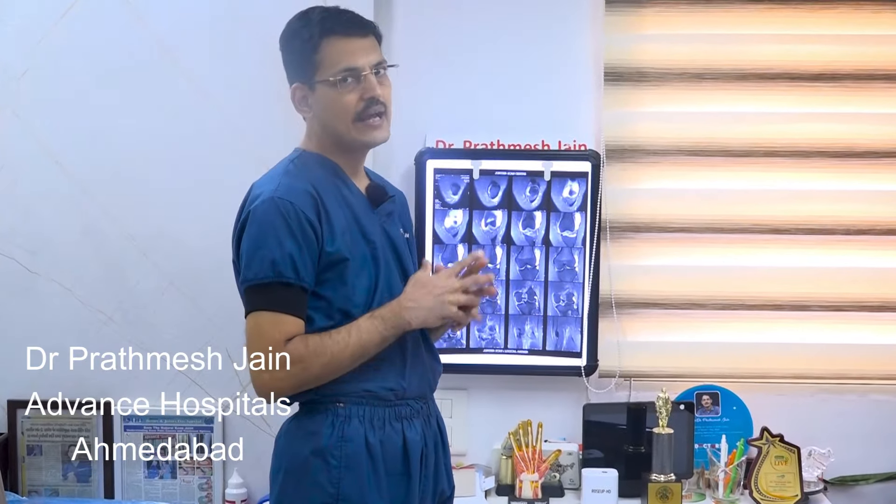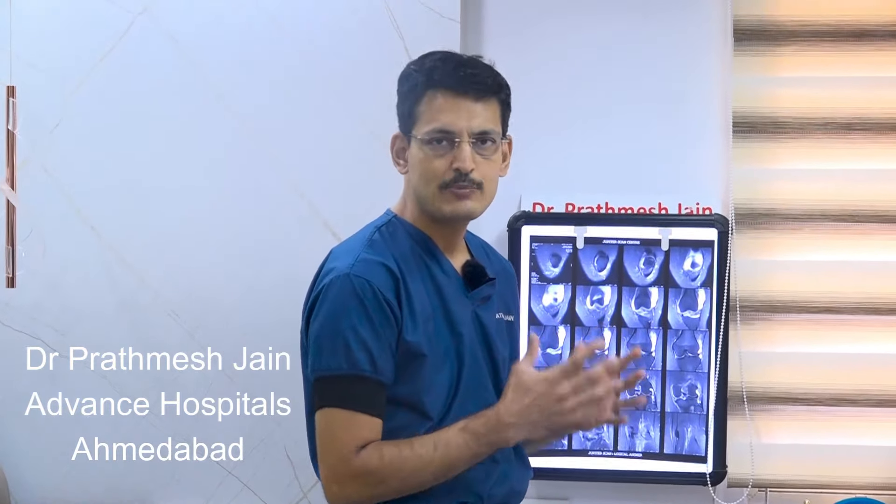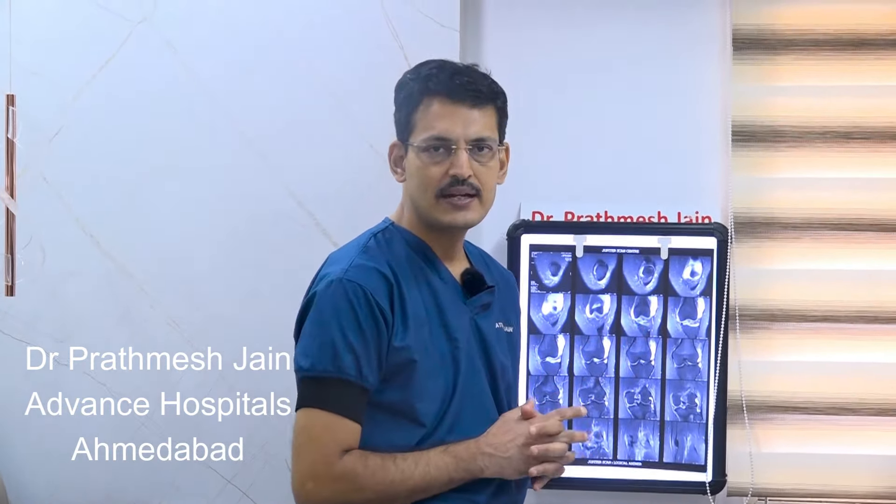We will be demonstrating the repair techniques of a locked bucket handle tear — how we reduce it and how we repair it. The inside-out repair remains the gold standard for bucket handle tears, and we will be using the Stryker SharpShooter system to repair it with a posterior medial safety incision. We will also be doing an ACL reconstruction with a Button ProCinch on the femoral side and a Stryker screw on the tibia.